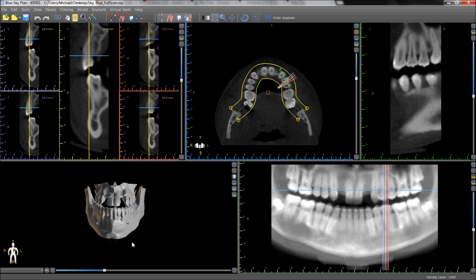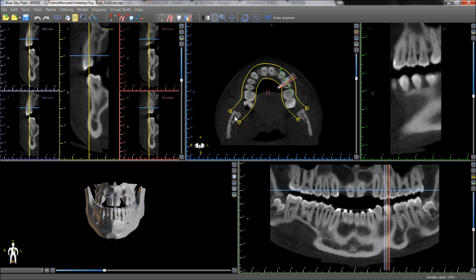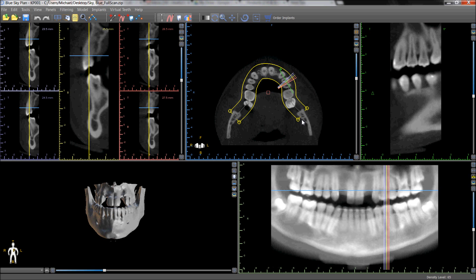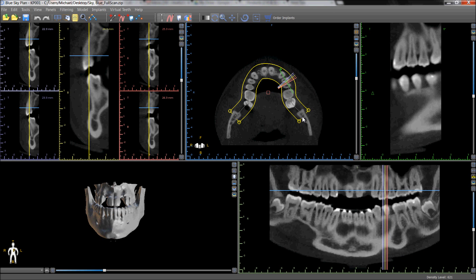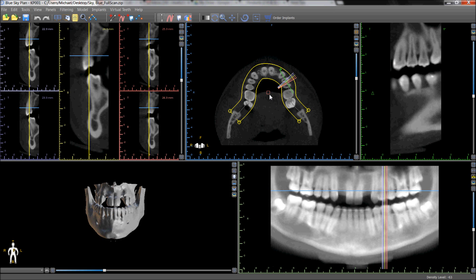If any fine-tuning is desired, it can be done by grabbing the squares along the panoramic curve and moving them to the desired location. The curve can be moved in its entirety by grabbing the pink square in the middle and dragging it.